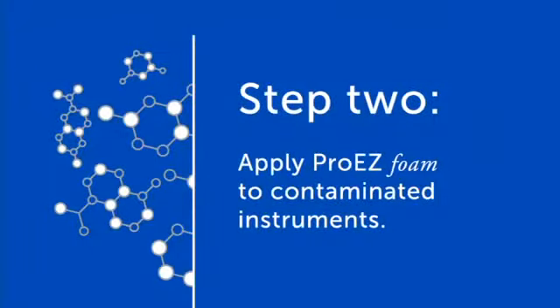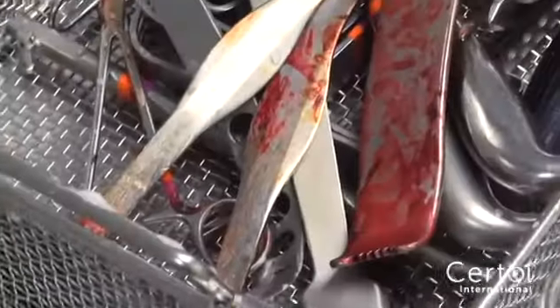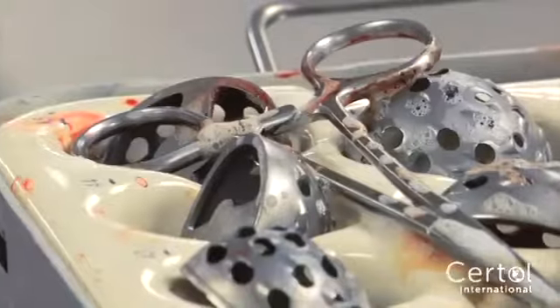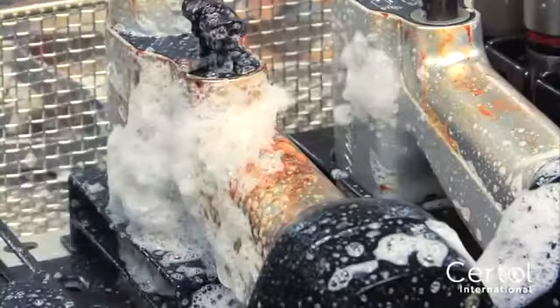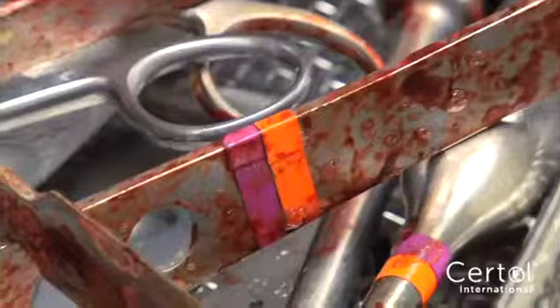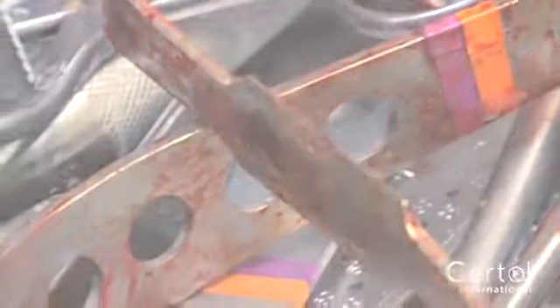Step 2. Apply ProEZ foam to contaminated instruments. Do not dilute. The product is ready to use. Spray about 6 to 8 inches from instrument surfaces. Spray directly on visible soils and onto box locks, serrations, and other heavily contaminated areas.